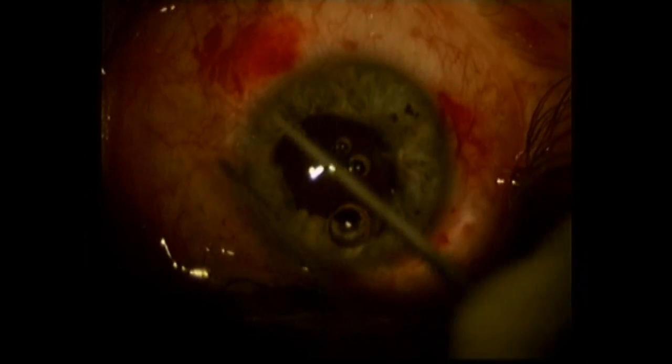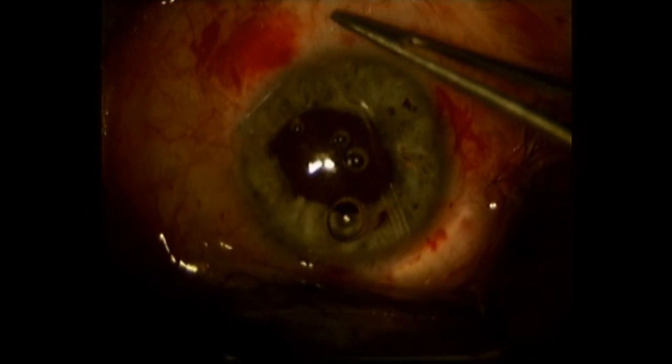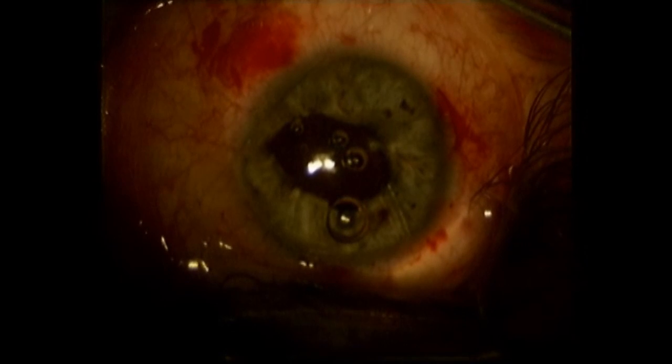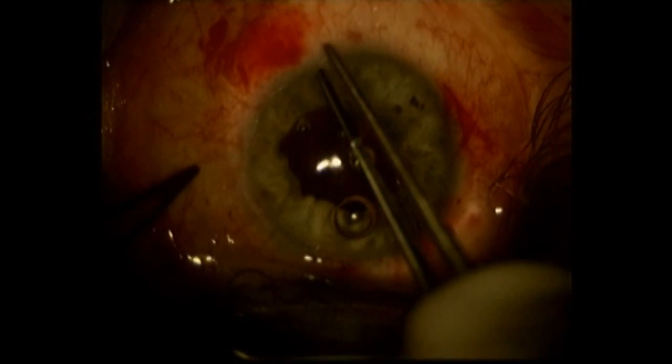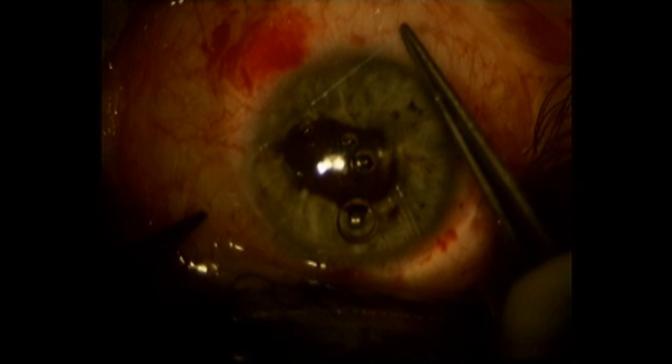I'm going to tie here in a slipknot fashion — you'll see this kind of gently brings down the pupil. You don't want to be overly aggressive here. You're trying to functionally and cosmetically match the other eye under fairly routine lighting conditions, so you want to try to match the other eye.